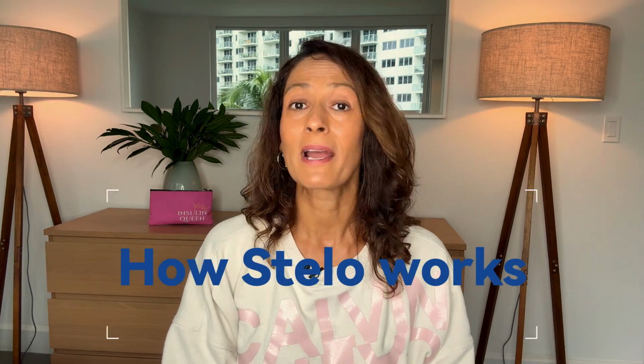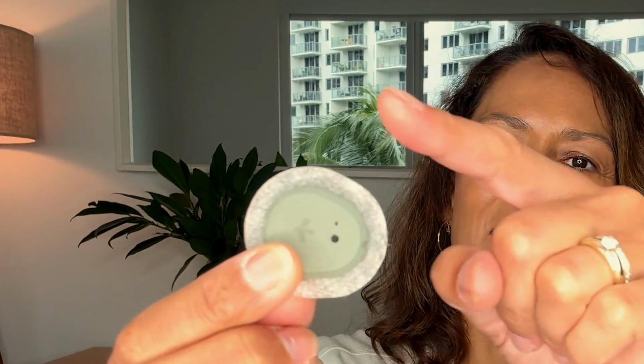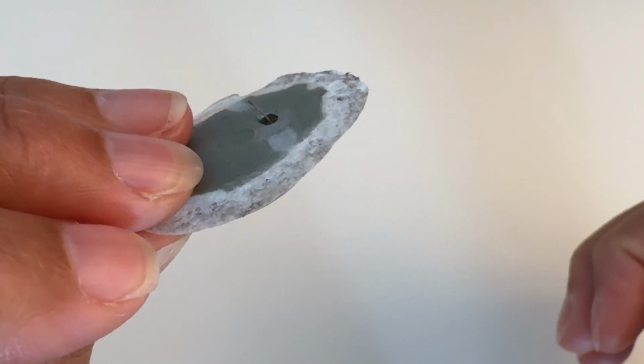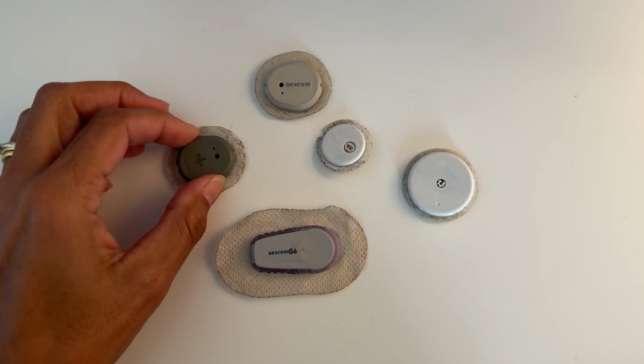Now that we know how a biosensor works, let's have a closer look at Stelo. This is a sensor that sits on the skin. You can see the tape here around, and this is a hard plastic. And this is a little soft sensor that sits underneath the skin. You might have seen other sensors before, maybe in the wild, or you tried others, but here we have a close-up of what Stelo looks like compared to other CGMs that I've tried.